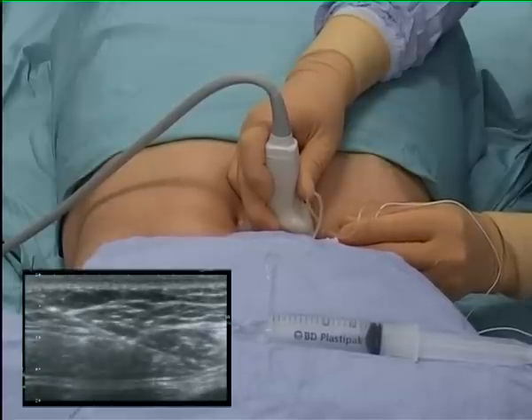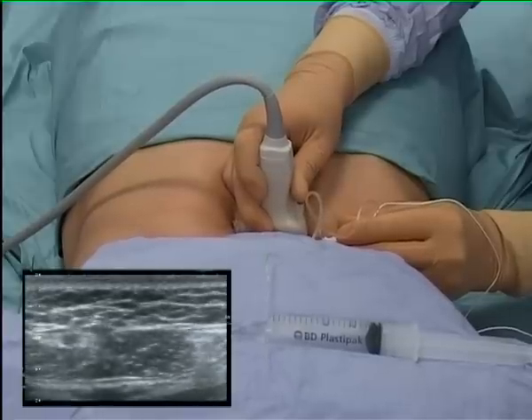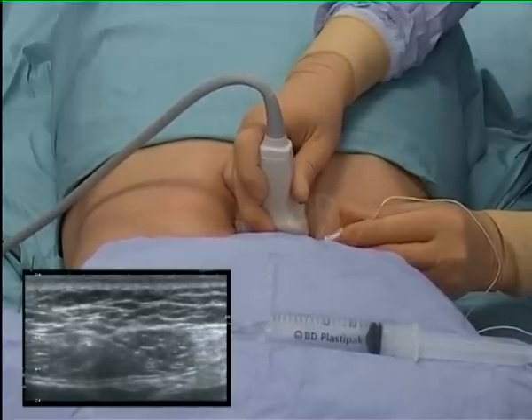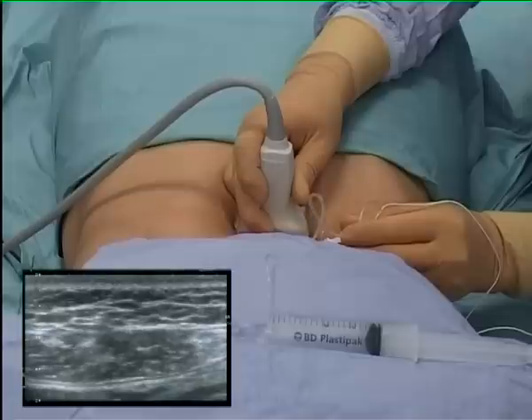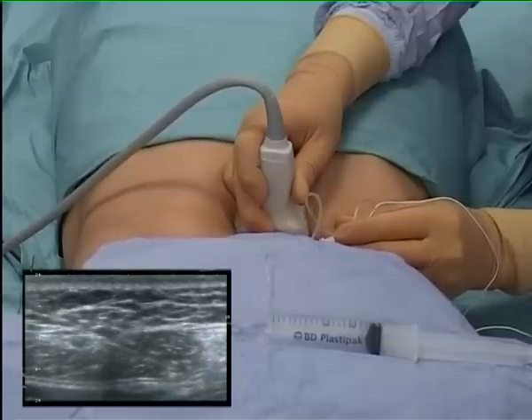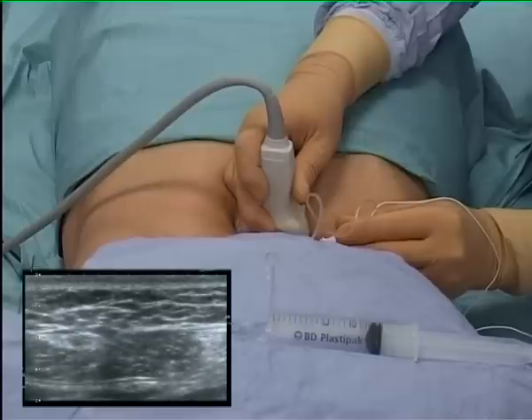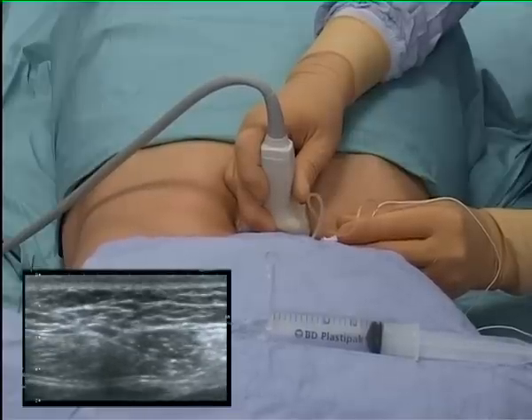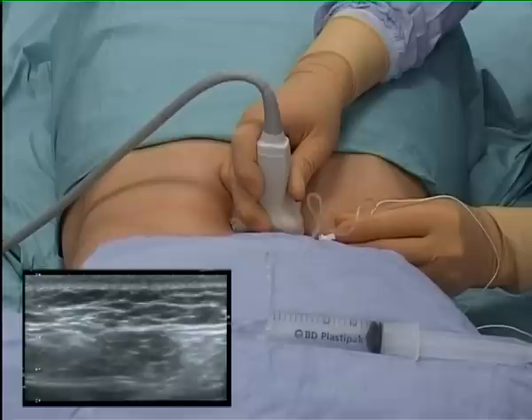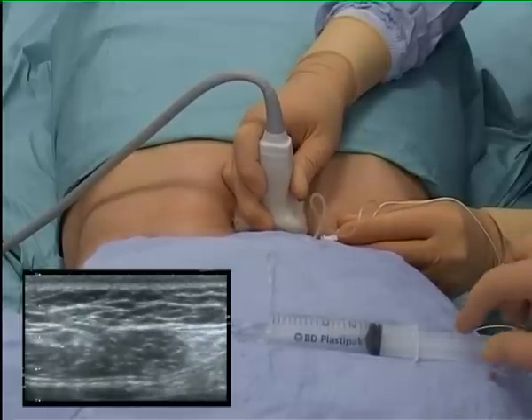As the tip approaches the posterior aspect of the muscle, needle movements must be carefully controlled due to the very close proximity of the peritoneum. Once the needle tip lies posterior to the muscle and on the rectus sheath, a small test injection is made to assess local anesthetic spread.